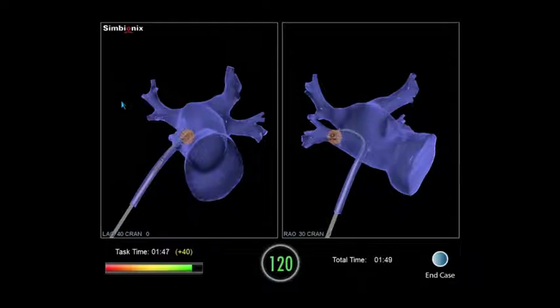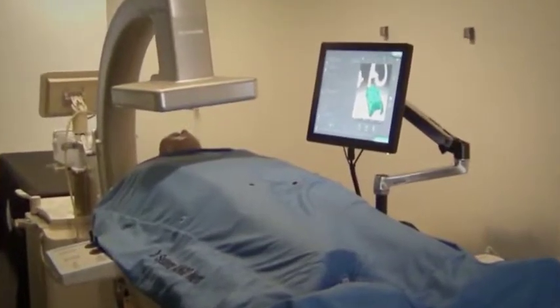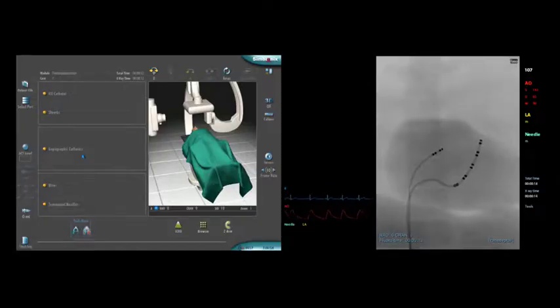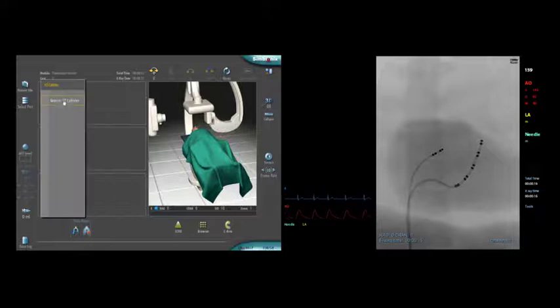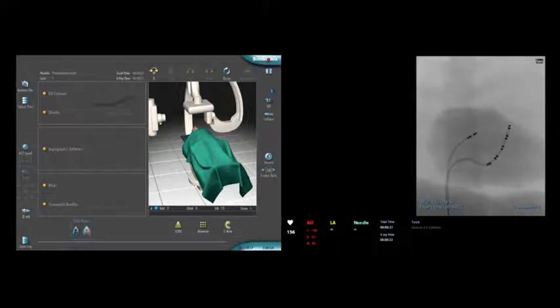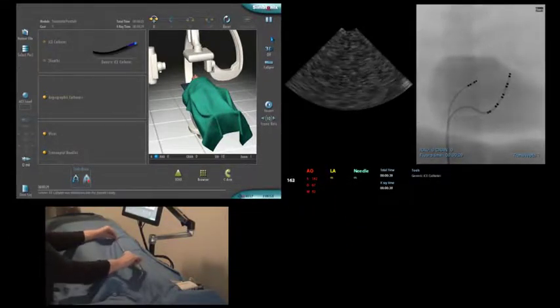Maybe we can switch to the next movie. The same very elegant suite for simulation, and again, it's not easy to reproduce completely a virtual lab. Here is just to say that we have on the right side the virtual reality screen, and on the left side the computer screen.